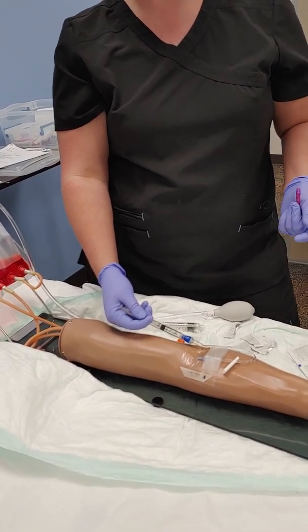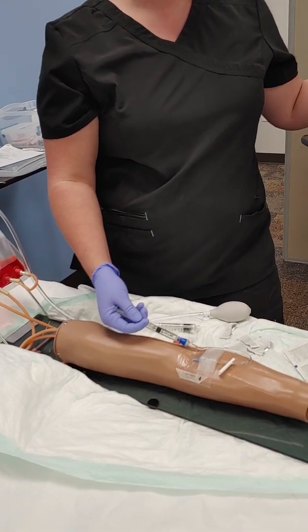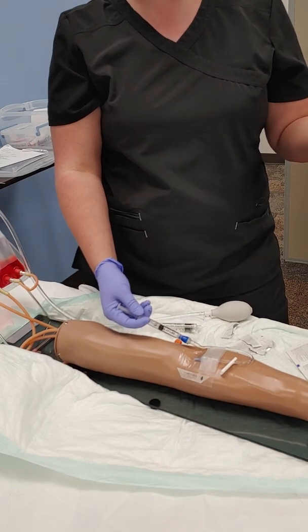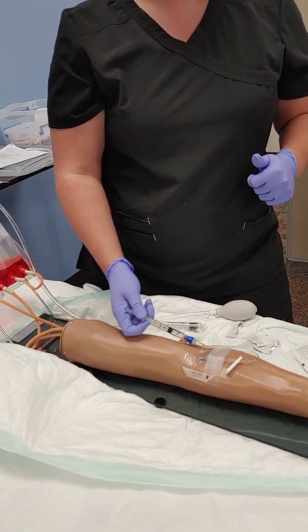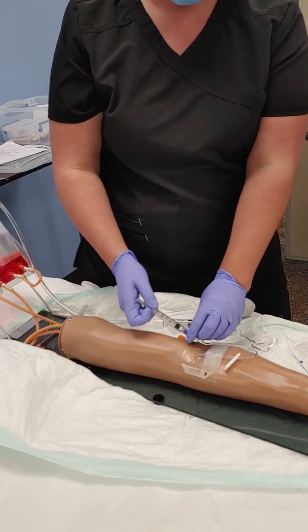Now for competencies, you need to state the correct rate that you're pushing it in. You don't have to stand here for the full minute and push it in. Or in some cases, some of those drugs are over 3 to 5 minutes. So I need to hear the correct rate, and I need to hear if you need to dilute it. So we're going to say it's been a minute. Go ahead. Inject medication at recommended rate.